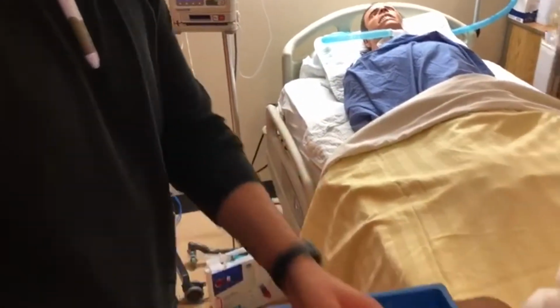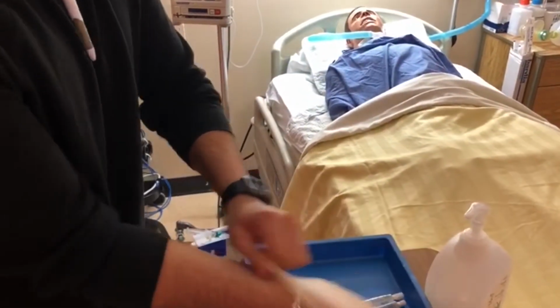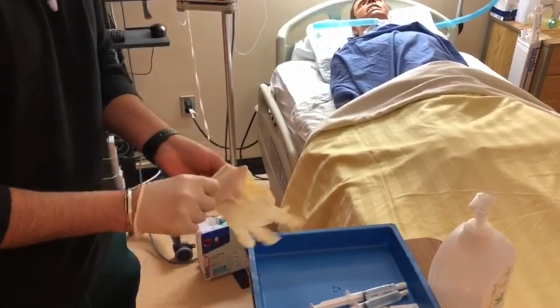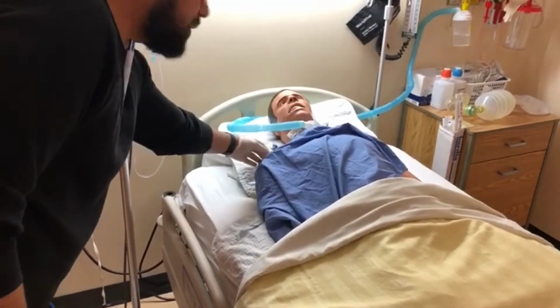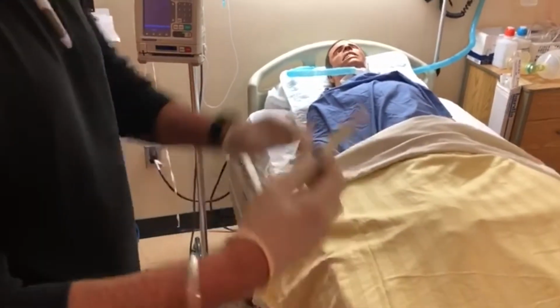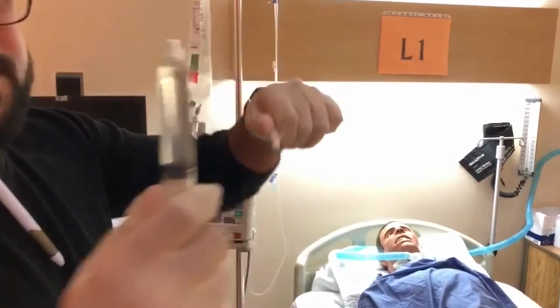Initially, what we can do is put some gloves on and flush the CVAD to assess for patency. So we can do that real quick. The one that I would want to be going into is the clear one. You don't want to be going into the brown one because that's the one meant for blood. So what we can do is prep our syringe. We want to take the air out, so we're not putting any air in.